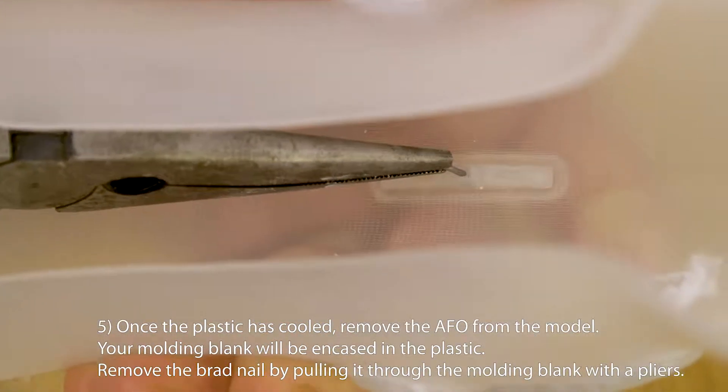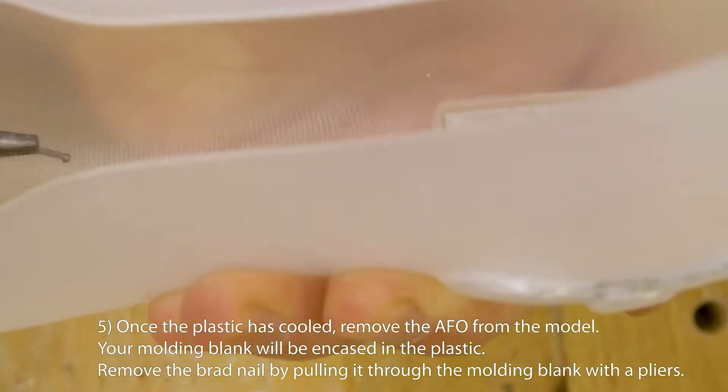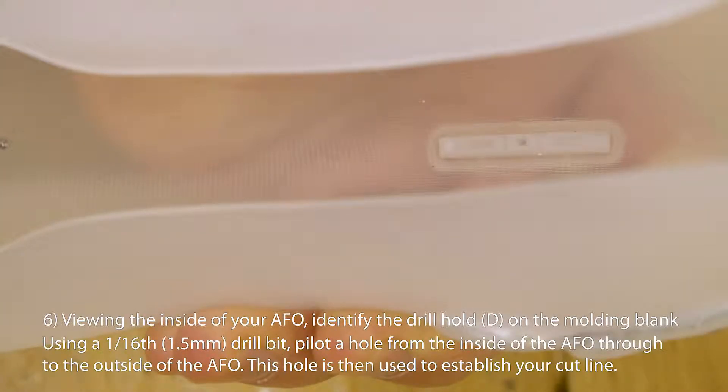Remove the brad nail by pulling it through the molding blank with the pliers. Viewing the inside of your AFO, identify the drill hole D on the molding blank. Using a 1/16th drill bit, pilot a hole from the inside of the AFO through to the outside of the AFO.